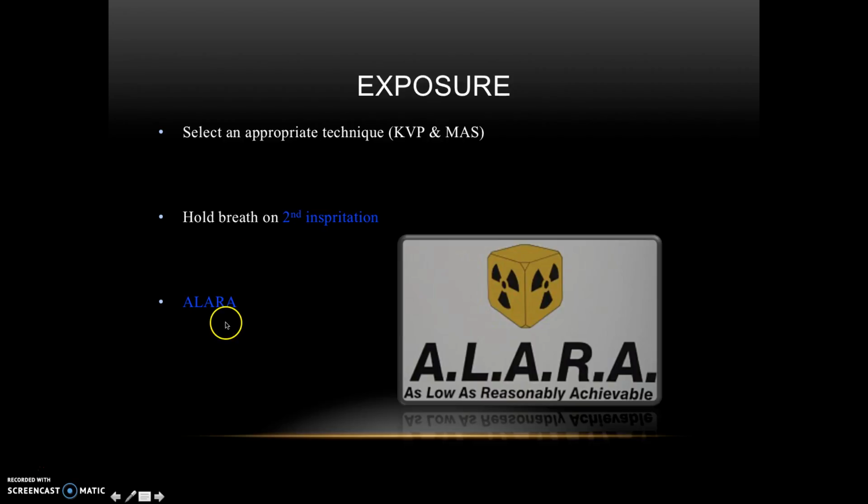And again, with any x-ray, we're using radiation, so we need to keep this in mind. This is an acronym. It says ALARA. It stands for as low as reasonably achievable. This means we're using the least amount of dose that we can use without interrupting the diagnostic quality of the image. So as low a technique as you can use without overexposing the patient and still getting a good image.